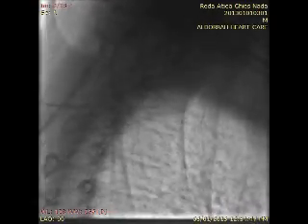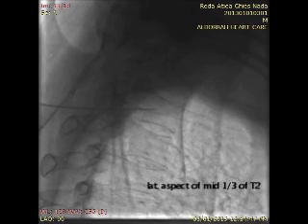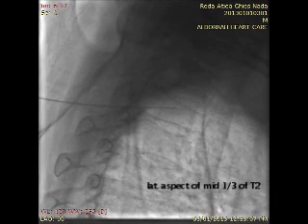Once the needle is in the correct position, which is the middle one-third of the vertebral body, a contrast material is injected to make sure that there is no intravascular nor pleural spillage. The confirmation is done through an AP view.